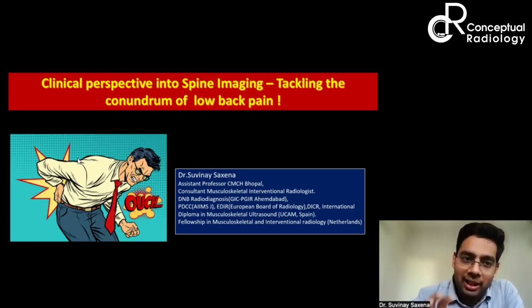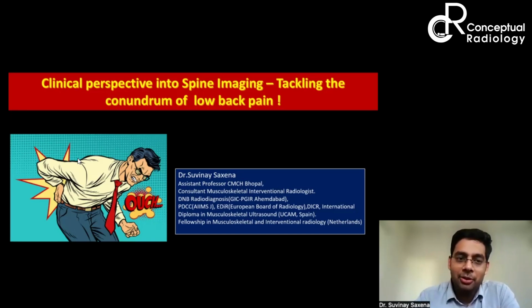My goal is to build your concepts so that even if you go and read textbooks, you can read the textbooks, but how to approach an MRI actually would be really helpful. So at least you know how to read the MRI. That is my primary goal with this presentation.